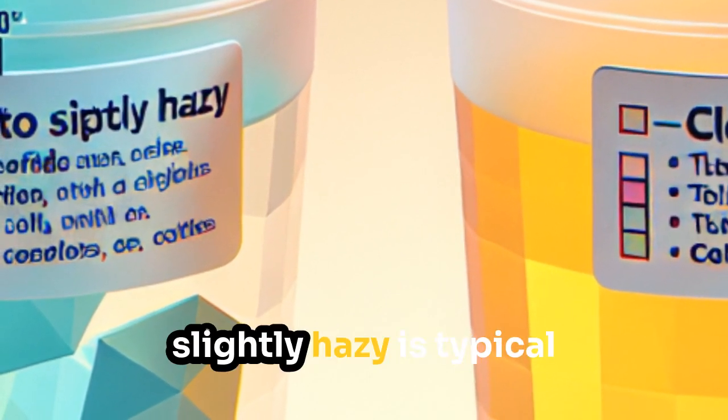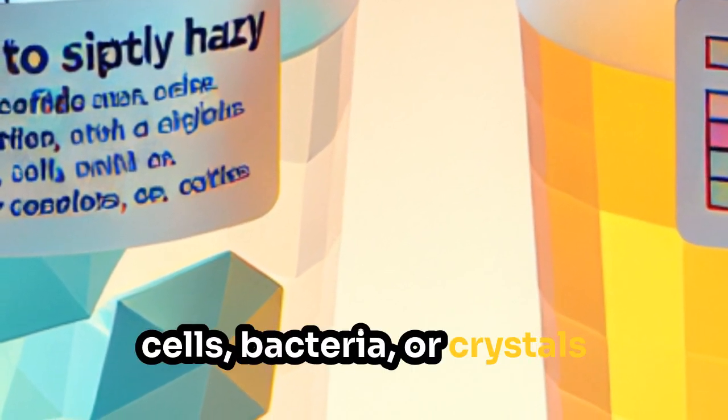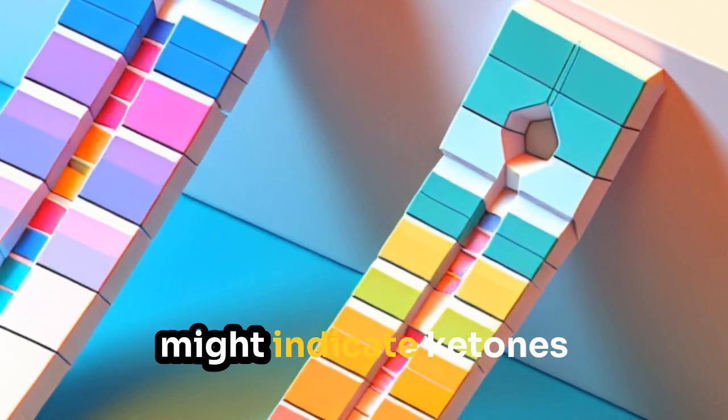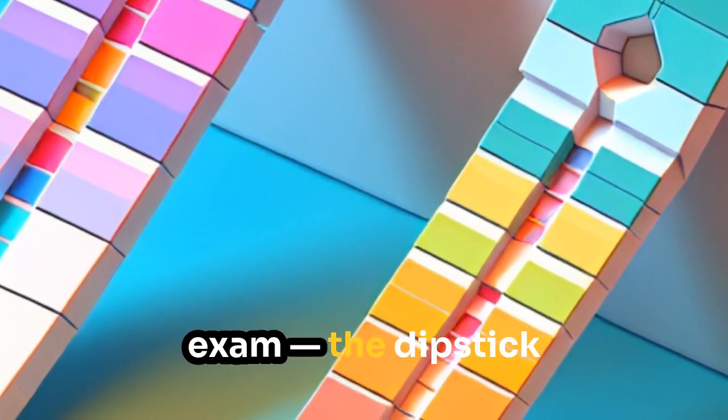Clarity: clear to slightly hazy is typical. Turbidity could suggest cells, bacteria, or crystals. Odor: fruity smell might indicate ketones and diabetic ketoacidosis. Next, the chemical exam, the dipstick.